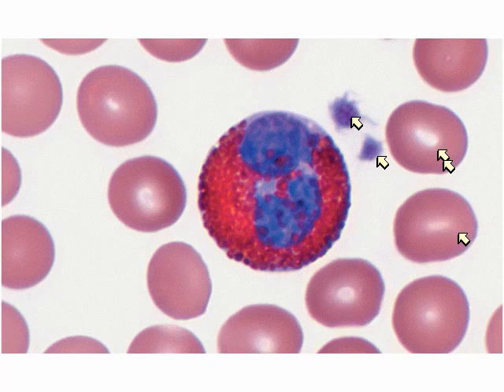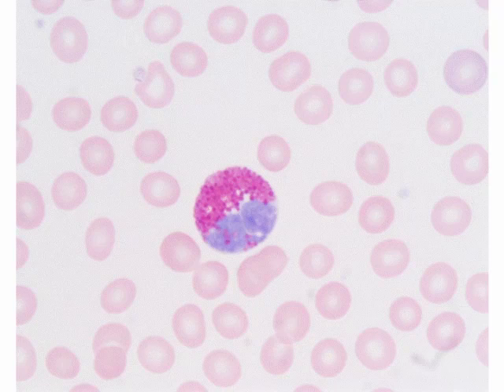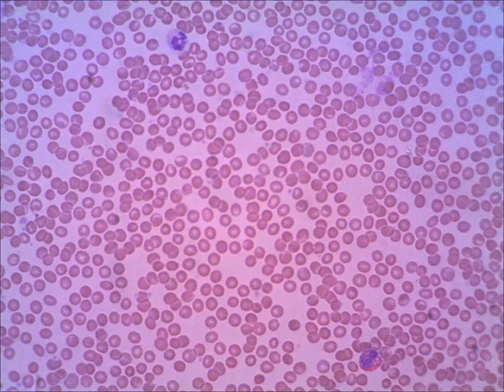Most of the time, eosinophils have a bilobed nucleus, but all of the time, they have these granules that stain red. Now, this picture comes from your textbook, and the redness doesn't show up quite as much. You do see some platelets over here on either side, but you can see the bilobed nucleus of the eosinophil. On the next slide, we can see another view of the eosinophil, and here the redness of the granules really appears. When I give you pictures like this for your lab quiz or a lab test, I'll try to get some that the granules show up real well for you. It won't be one that would be difficult to identify.